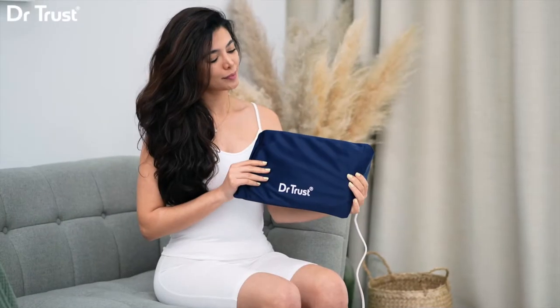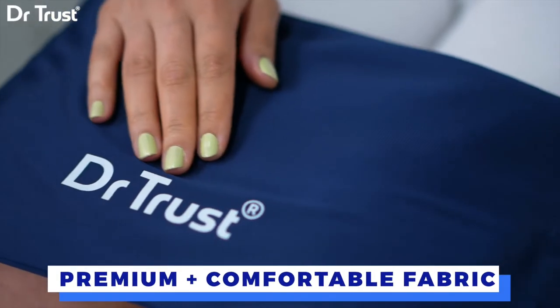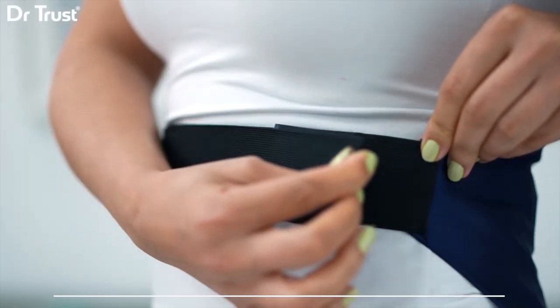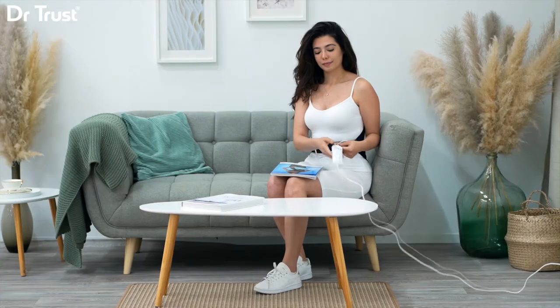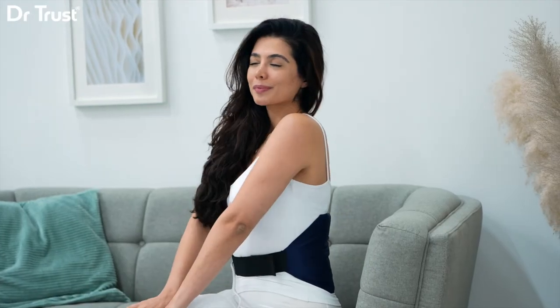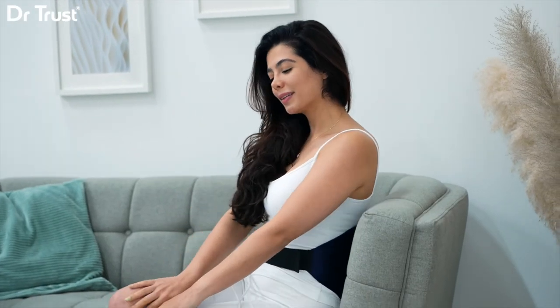Simply wrap it around your waist and let the magic begin, cocooned in the lap of luxury, thanks to our premium, comfortable fabric and exceptional safety features. With its temperature controller, you can choose the heat level that's just right for you, whether it's for aches, pains, or those chilly nights.